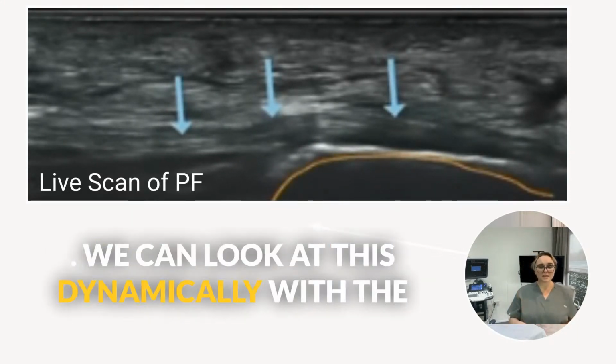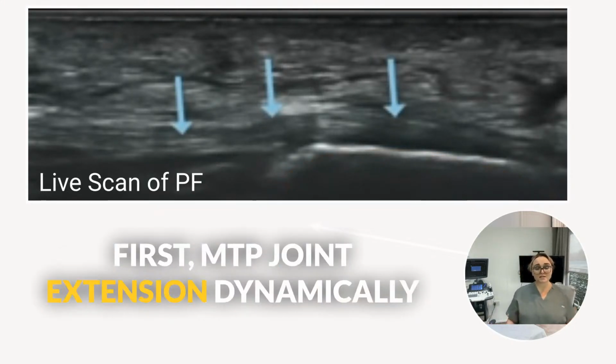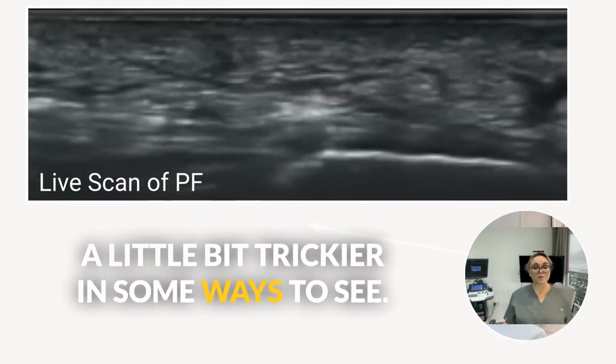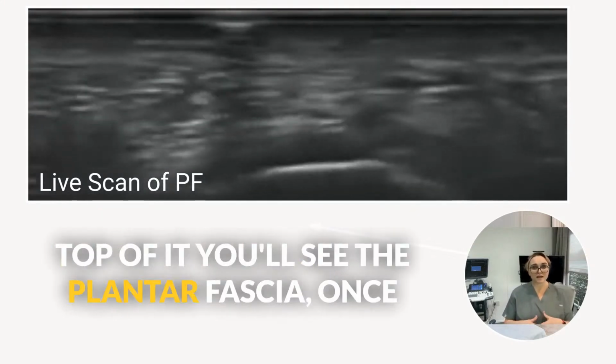We can look at this dynamically with the windlass mechanism. First, MTP joint extension dynamically tensions that up. Now we can go into short axis, which is a little bit trickier in some ways to see, highlighting that calcaneus, and on top of it you'll see the plantar fascia.